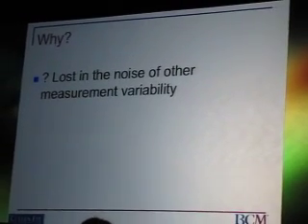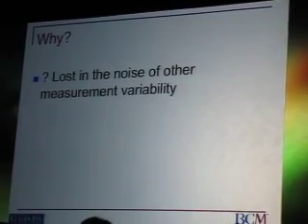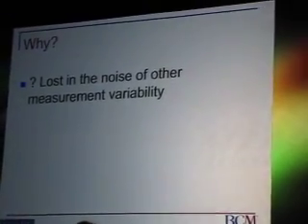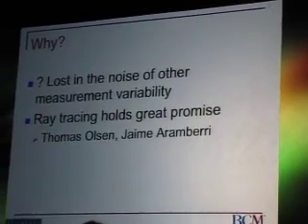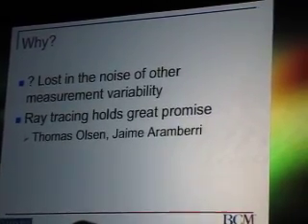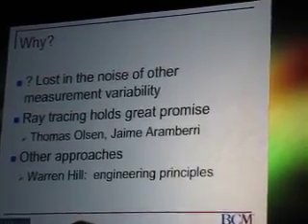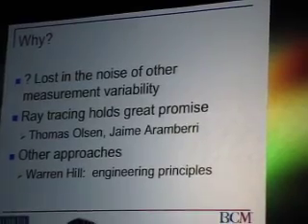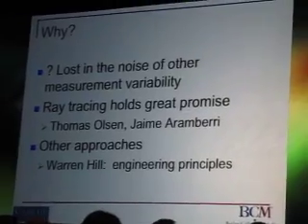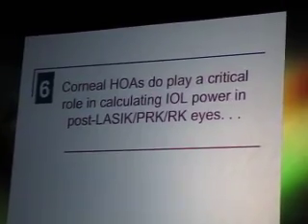But currently, I think that spherical aberration is sort of lost in the noise of the errors and the other measurement variability. Ray tracing holds great promise, and I want to acknowledge the work in this area that Thomas Olsen and Jaime Aramberri are doing. And another approach, Warren Hill is looking at engineering principles. It'll be interesting to see if his approach shows that spherical aberration is important.